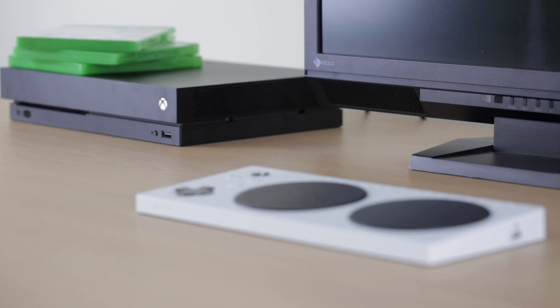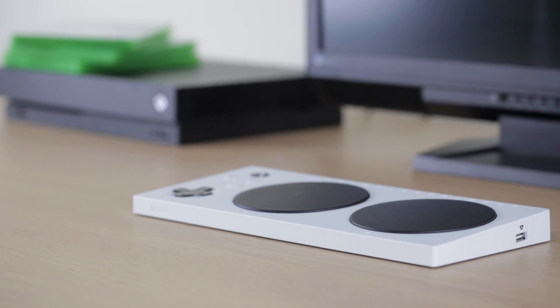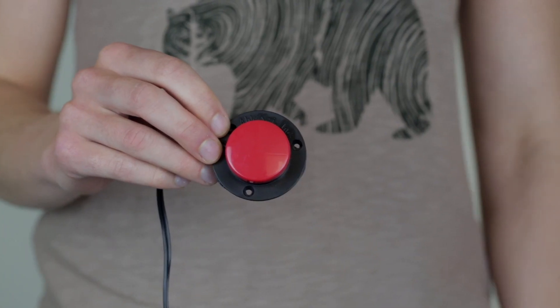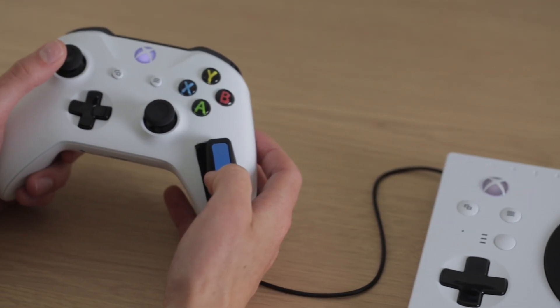The Xbox Adaptive Controller is a device from Microsoft which is designed for gamers with limited mobility to make gaming more accessible. While the Xbox Adaptive Controller does have other accessibility features, in this video we are going to be looking at some of the switches we use here at Special Effect and how to use them in the Adaptive Controller.